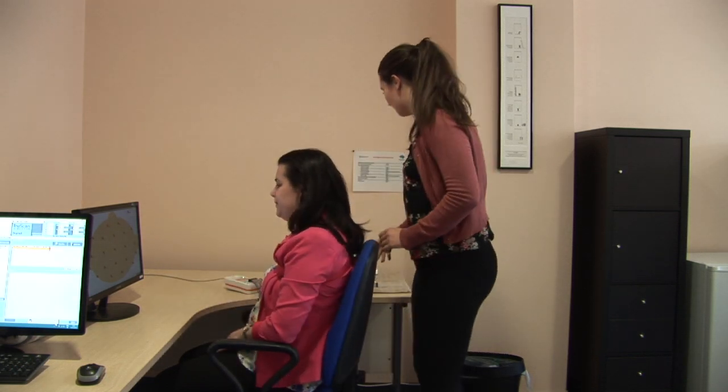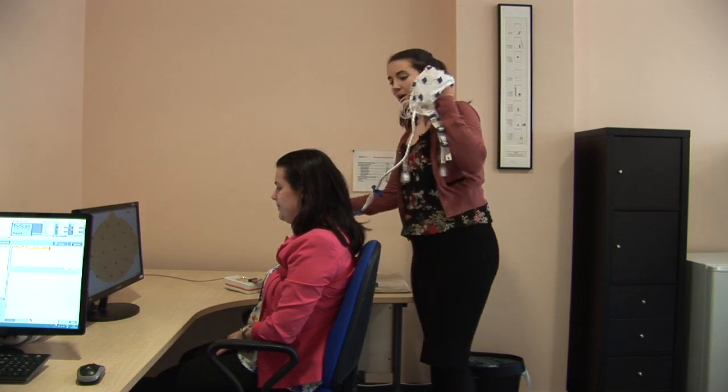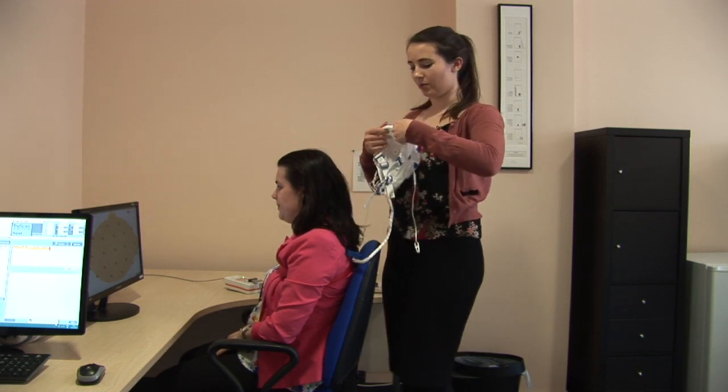And you can pop your arms back down. Okay, so the cap goes on just like a swimming cap, so we're going to go from the front to the back.